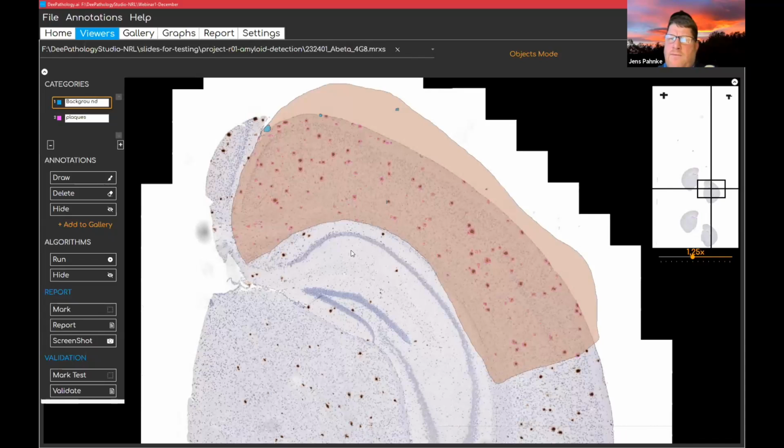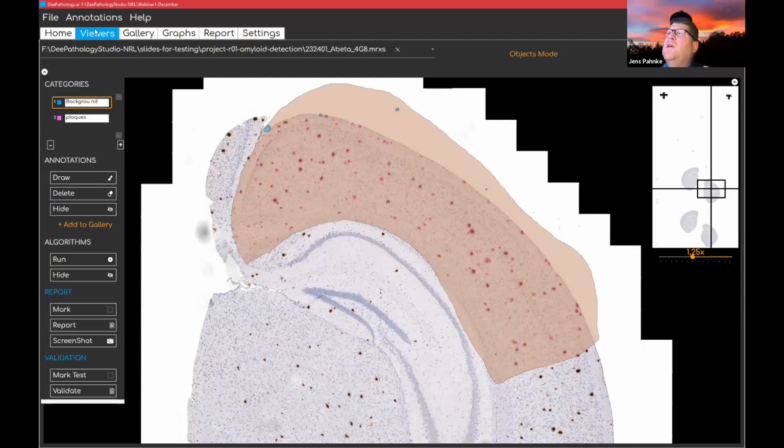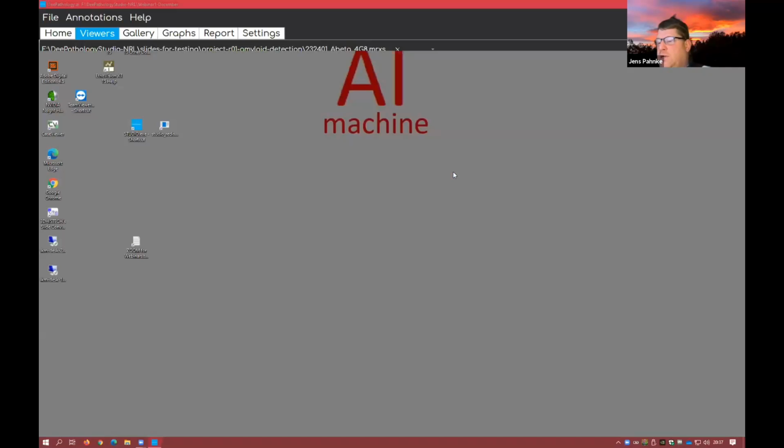Okay. If you want, yes, you can also use images. This is another mode, the cell mode. It will detect different images and give you also a gallery of images. This is here, but for the plaques, I use another mode. You see also the epochs for teaching. So you can do this for single cells, for example, if you have cytology, or if you have cells within a tumor, special cells that you are looking at. So you can also teach it for certain cells. That's also possible.